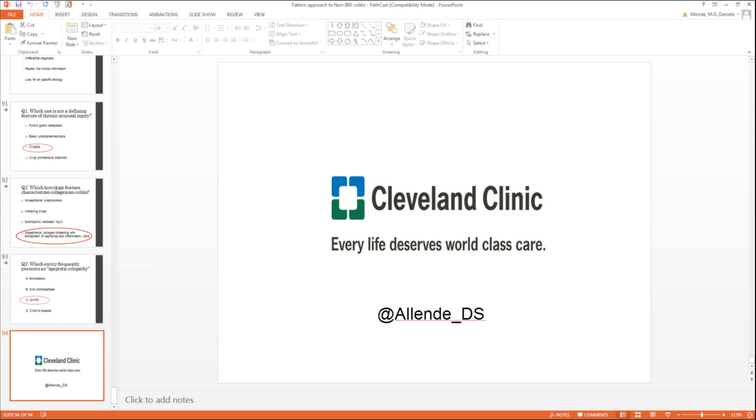Another question is from Dr. Patel. How do you report cases of chronic active colitis on biopsy where the differential diagnosis includes IBD and diverticular disease-associated colitis? Yes, that's a great question. When we have a biopsy, we report the pattern of interest. So in that case, if the features are chronic active colitis, that's what we say.